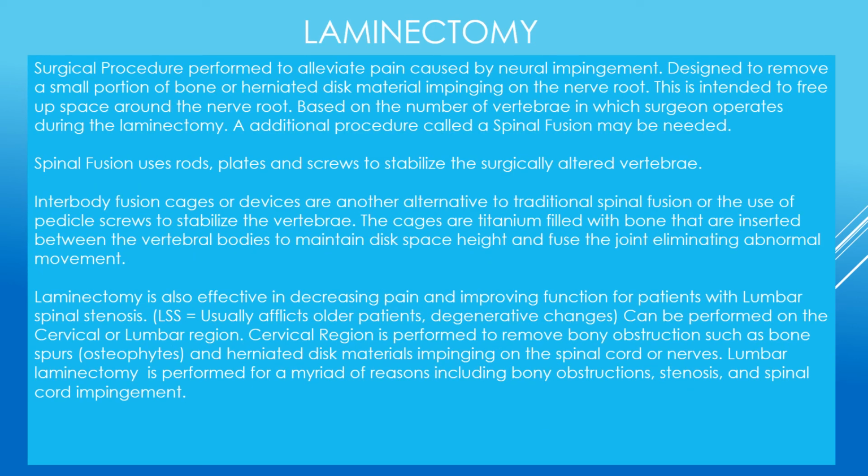Laminectomy, a surgical procedure performed to alleviate pain caused by neural impingement, designed to remove a small portion of bone or herniated disc material impinging on that nerve root. This is intended to free up space around the nerve root based upon the number of vertebrae in which the surgeon operates during a laminectomy. An additional procedure called a spinal fusion may be needed. Spinal fusion uses rods, plates, and screws to stabilize the surgically altered vertebrae.